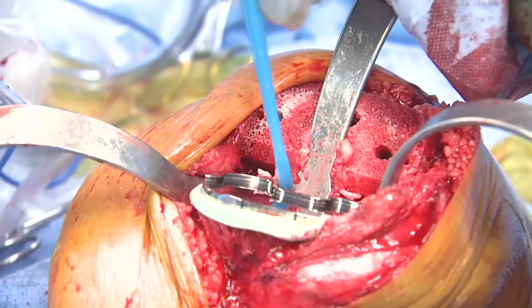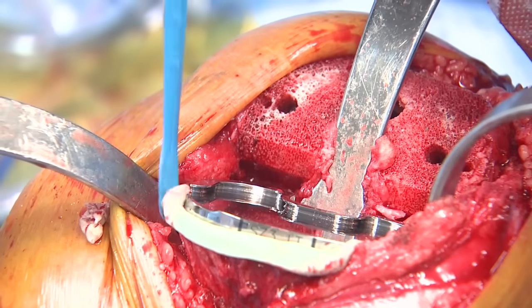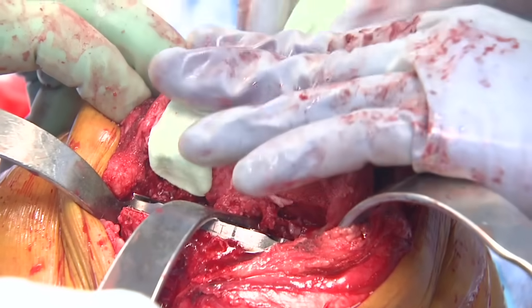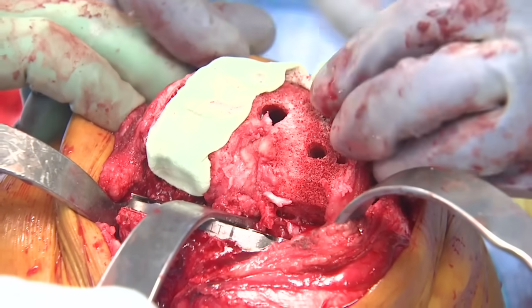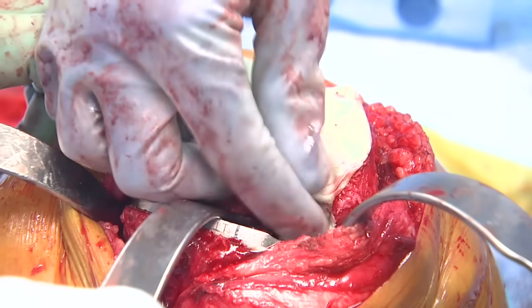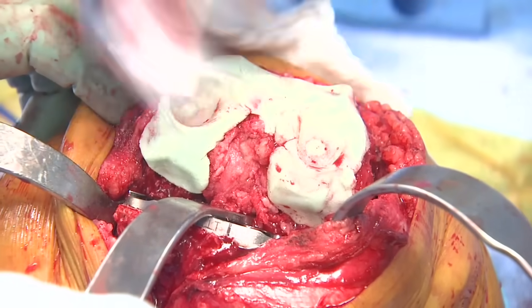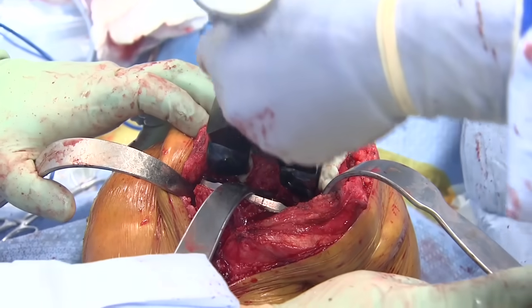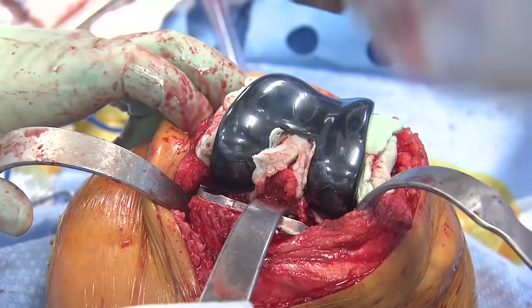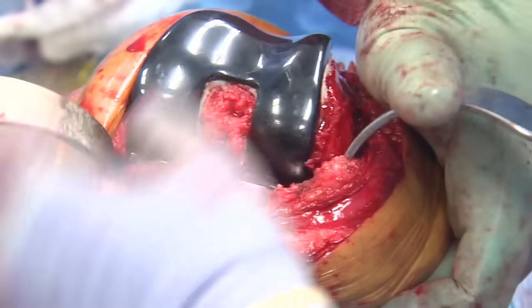Instruments are used to remove any excess cement from the knee, paying close attention to the posterior compartments. Cement is applied to the distal femur. Excess cement is removed and the trial liner is inserted into the knee.